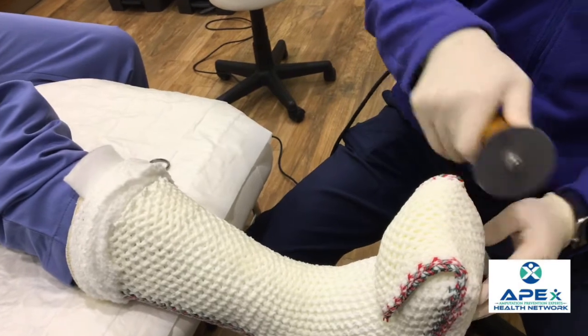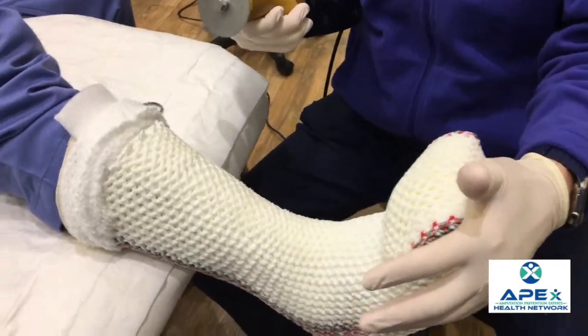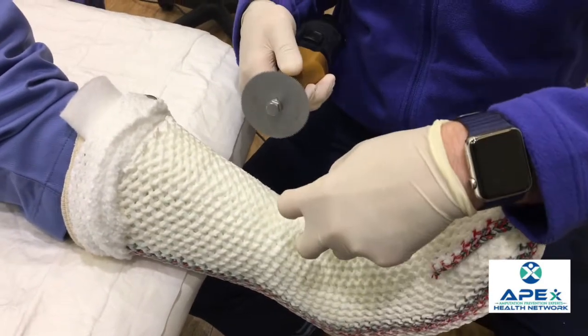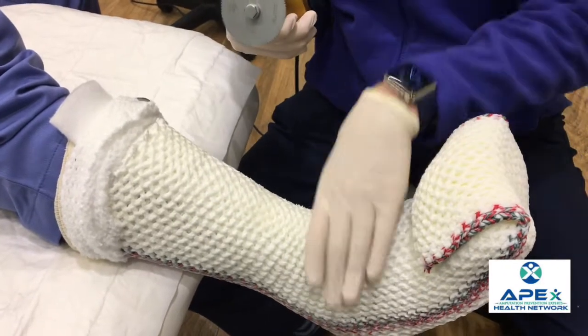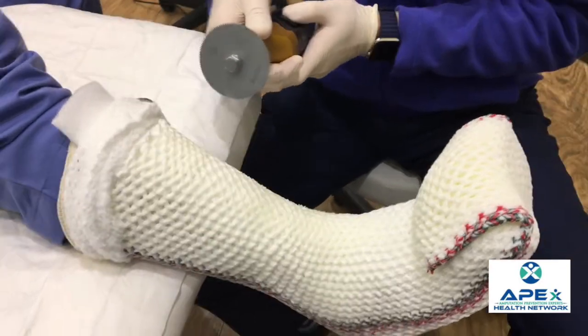We'll go over the toes just a little bit. You don't need cast spreaders usually because you can stretch this just with your hands to help get it off. But if you can't get it off, you can go along this part right here along the malleoli, because there's malleoli padding there as well.